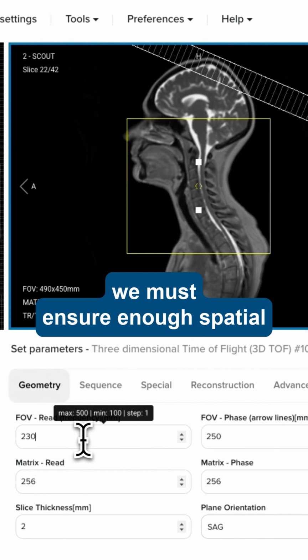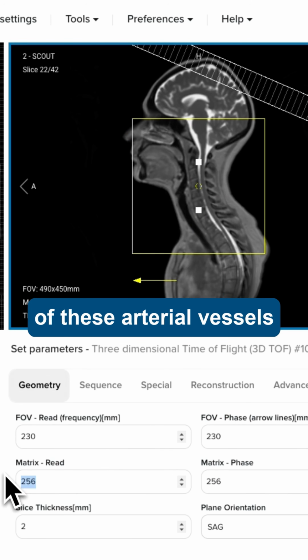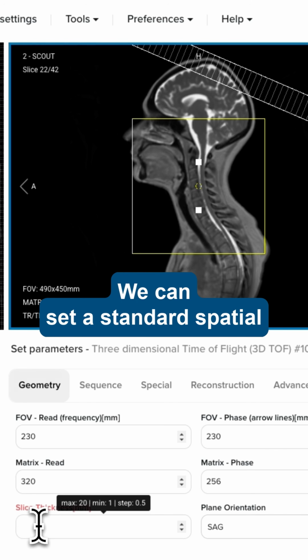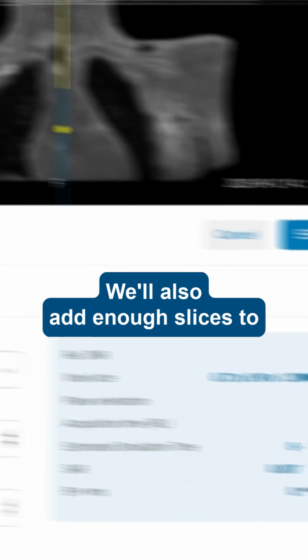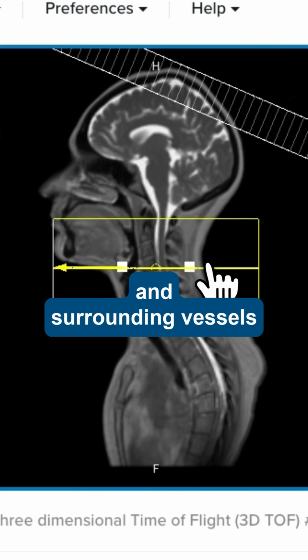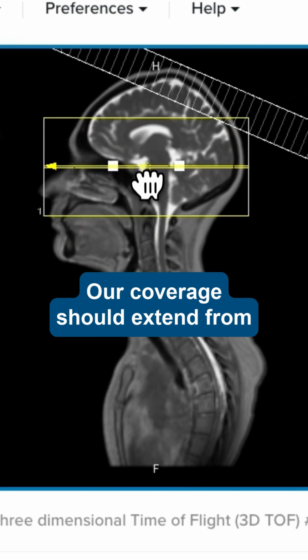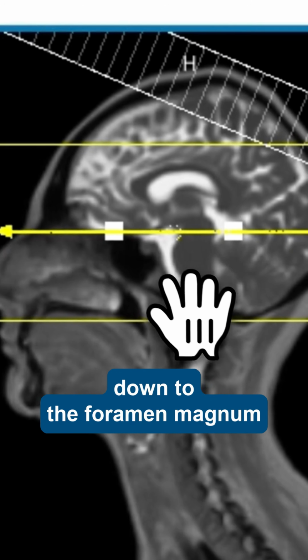First, we must ensure enough spatial resolution to capture the fine details of these arterial vessels. We can set a standard spatial resolution with our field of view, matrix, and slice thickness parameters. We'll also add enough slices to cover the Circle of Willis and surrounding vessels. Our coverage should extend from 1 centimeter above the corpus callosum down to the foramen magnum.